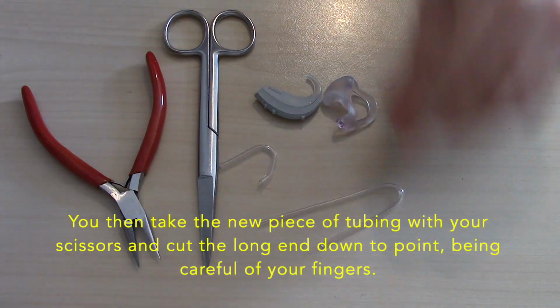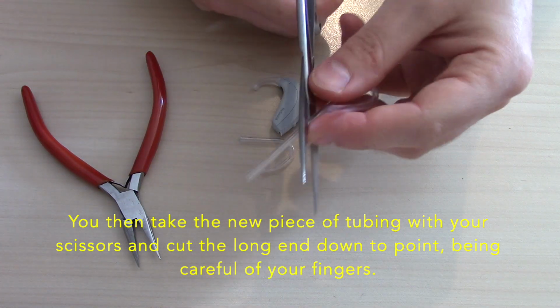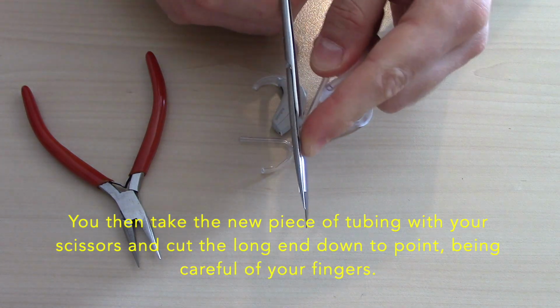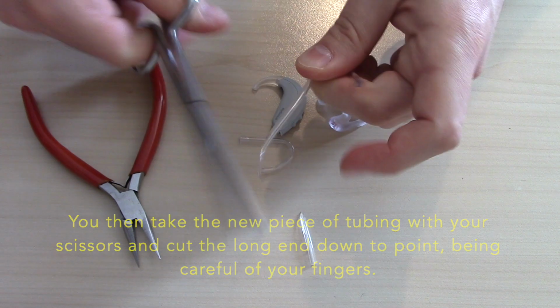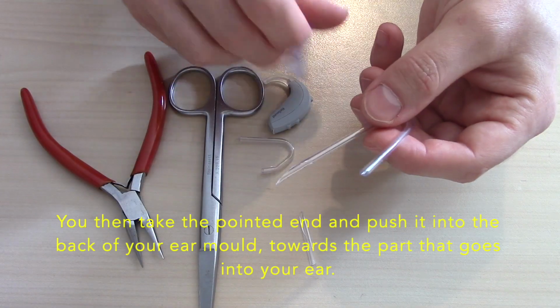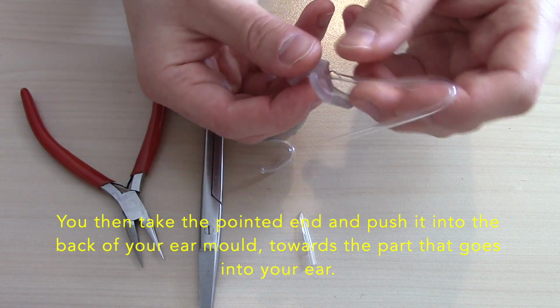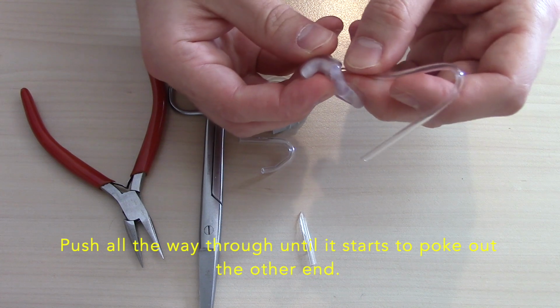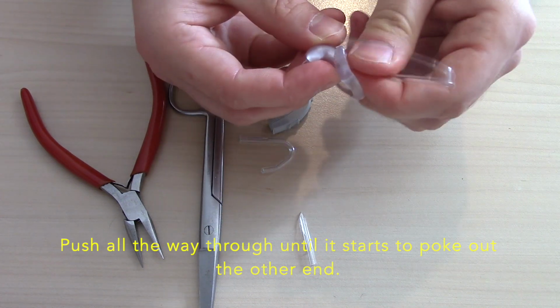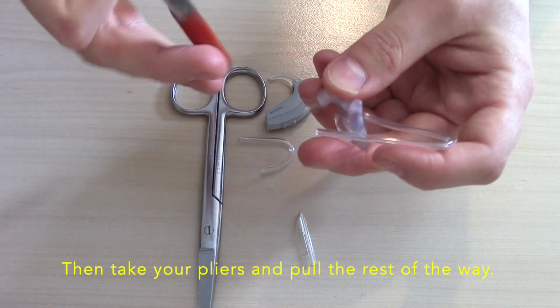You then take the new piece of tubing and your scissors and cut along the long end of the tube down to a point, being careful of your fingers as you do this. You then take the pointed end and push it into the back of your ear mould towards the part that goes in your ear. Push it all the way through until it starts to poke out the other end, and then you take your pliers and pull it the rest of the way.